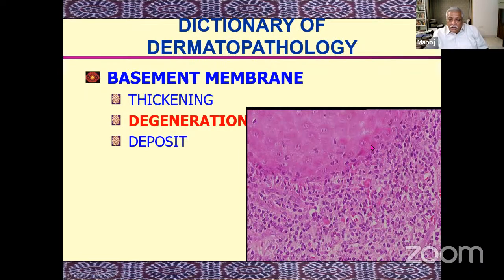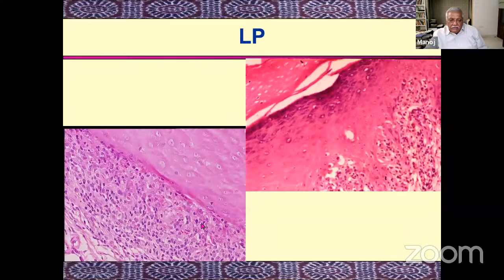A higher power of the same. Again, showing you these cells in the lower dermis, which are degenerating and falling down here, falling down here. These are the Civatte bodies. We've seen this.